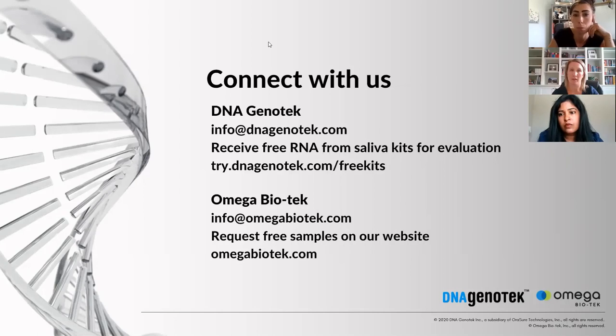RT-qPCR is a fast and relatively affordable way to screen samples for the presence or absence of SARS-CoV-2. So when quick population screening is required, for a simple yes or no answer, RT-qPCR often makes sense. In addition, there are several multiplex RT-qPCR solutions that offer rapid detection of several respiratory viral pathogens simultaneously from a single sample. This approach greatly reduces the reagents required for sample processing.